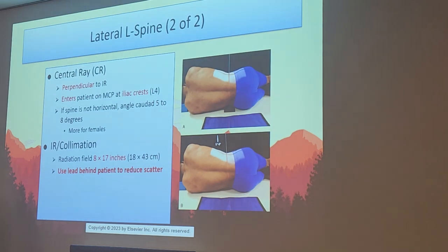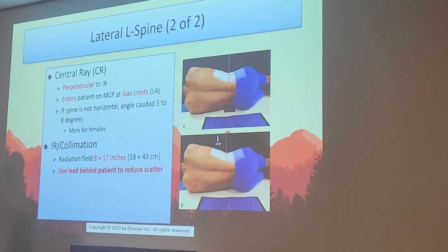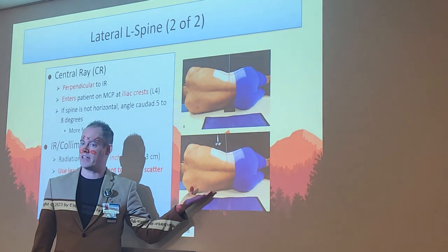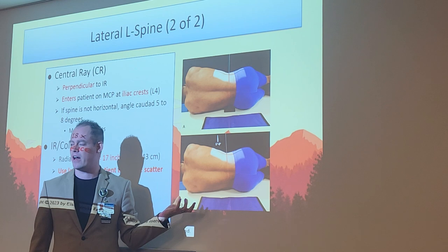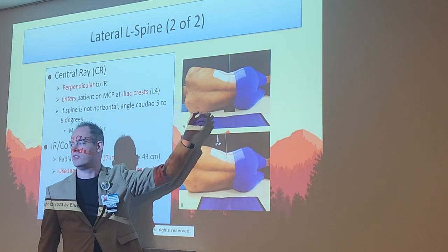All right, perpendicular central ray. We're going to enter right at the level of the iliac crest, also known as L4. And then they give you a little kind of cheat code there. If the spine is not horizontal, like they're laying like this, which most of us, let's be honest, are going to do our L-spines just like this. That's how we do it in clinic most of the time. We don't put support. If you're noticing that the spine is just really wonky looking on the lateral, you can actually add a slight angle to your tube, and it will kind of duplicate what you're doing up here.